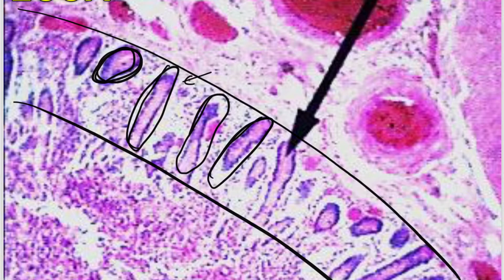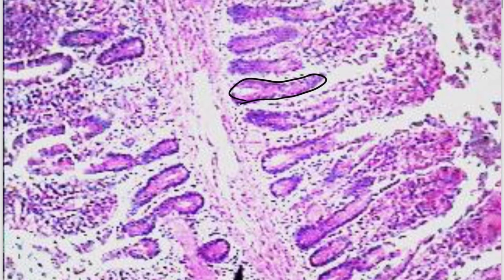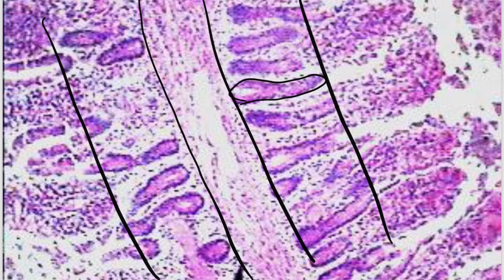So otherwise, I hope you can tell that this is simple in the sense that it's only one layer and that it is columnar. Now, on this one, this is also simple columnar, to which some people get a little caught up with the fact that it looks like there might be two layers. Right here looks like a layer, and right here looks like a layer. But this is actually only one layer. It is going to be coming down and encircling around like that. So you are seeing a single layer, but you can't see how it's all connected as one layer.